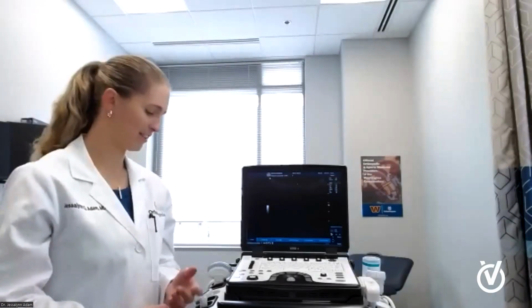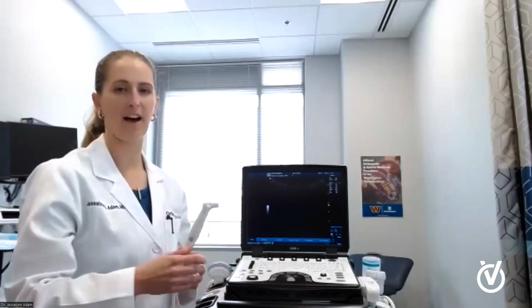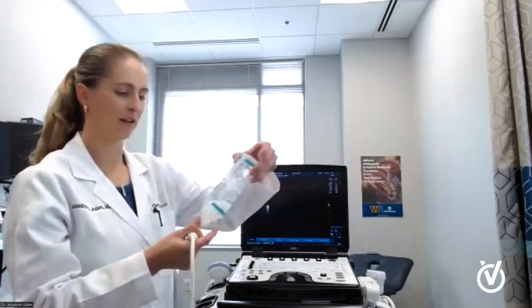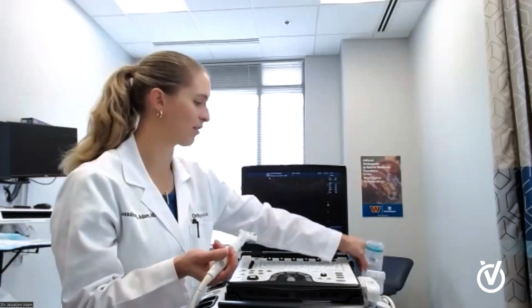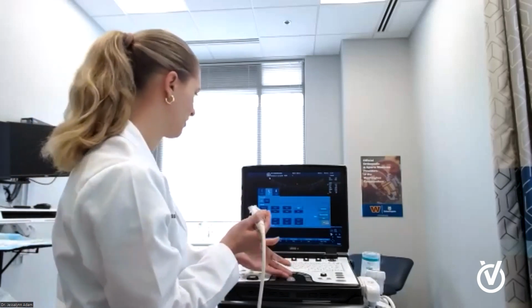Thank you. How much pressure do you have to use? Very light. So in fact, if it's a really sensitive area, there are all sorts of techniques that I have to even avoid putting pressure on altogether. So I can use extra gel and make it really thick so that I'm not pressing on the surface. So this is, let me switch back here again.